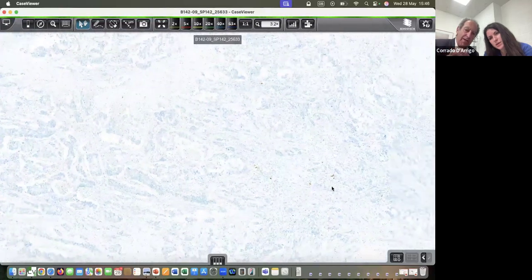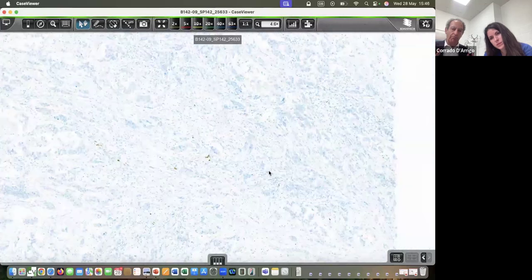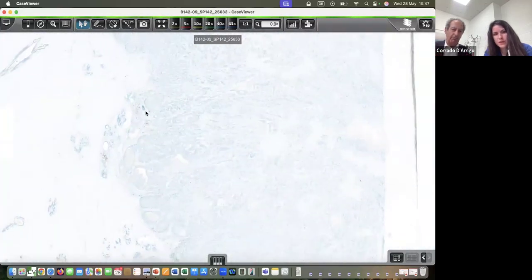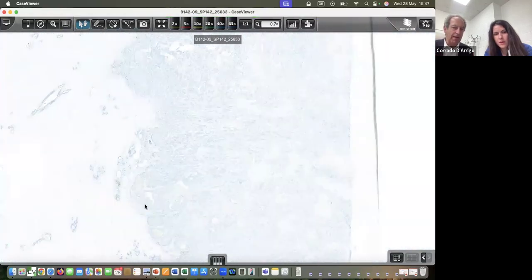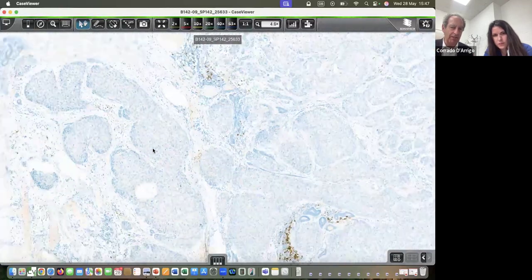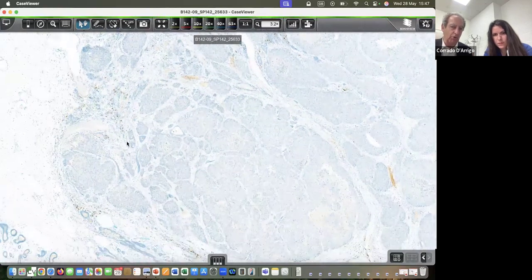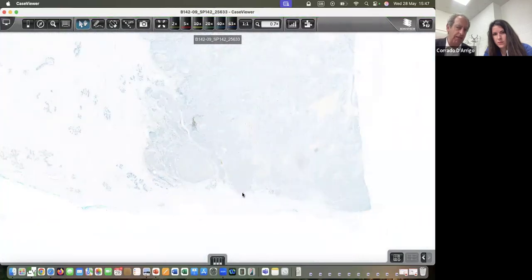So there are areas that are complicated. I think a case like this, you should approach it by dividing it into manageable areas, possibly of equal size, and then maybe help yourself with the atlas by comparing pictures and say, well, how much area positivity am I going to give to each one of these regions, and then make a total.